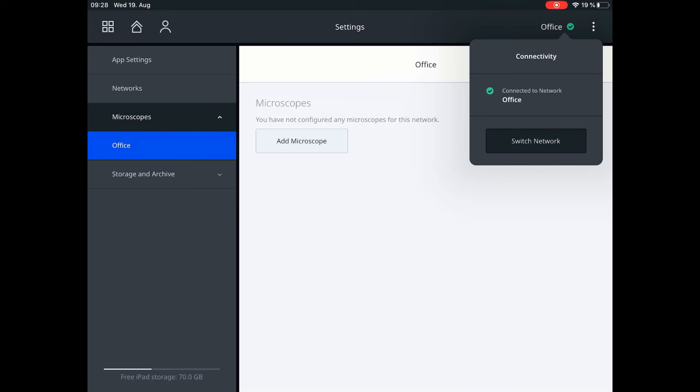This toolbar shows the current status of connection to networks, storages, and microscopes.